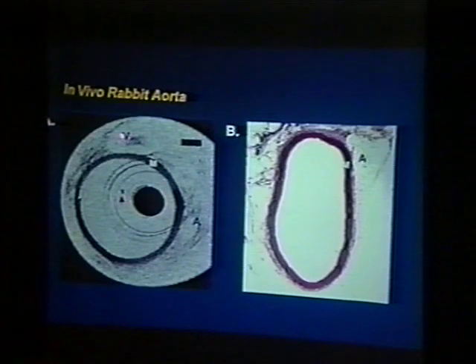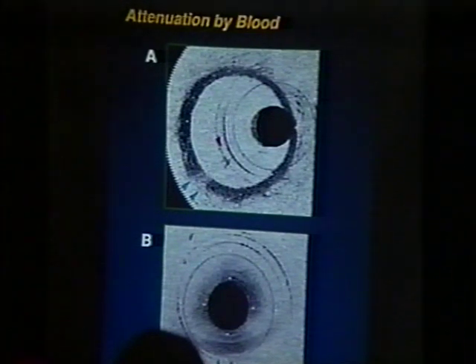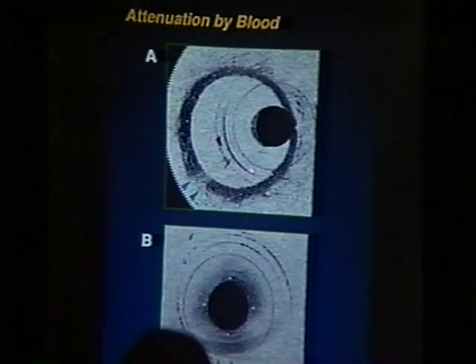I just want to go into some loose ends before going into interventional OCT. So those comparisons we saw, this is a plaque now that's been reconstructed in 3D, and the normal tissue has been subtracted out. This was done manually, but we currently have a program ongoing to do this in an automated fashion. But you can see that the fine structure of the plaque is sharply identified.